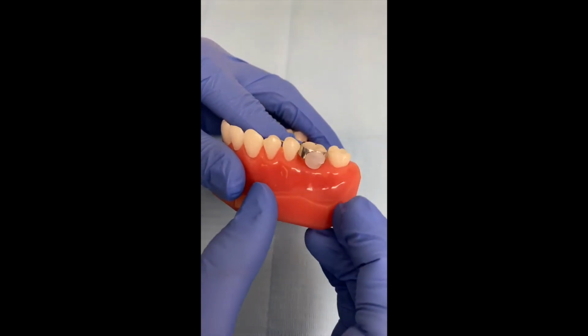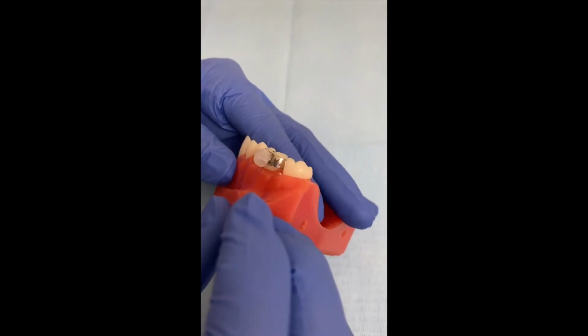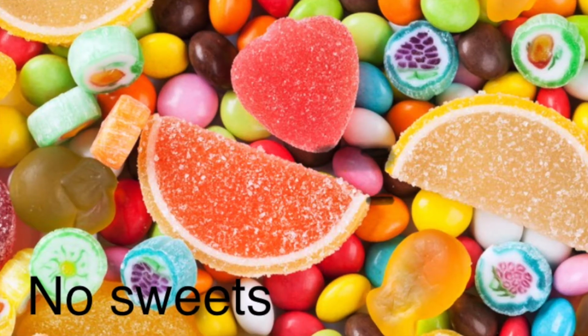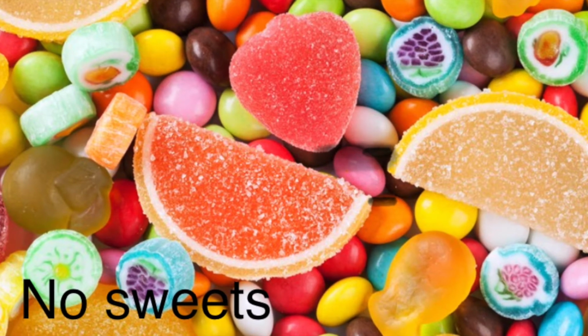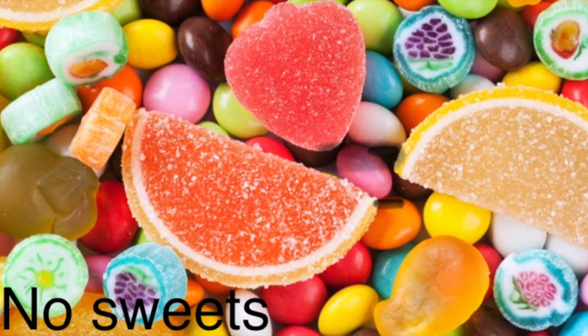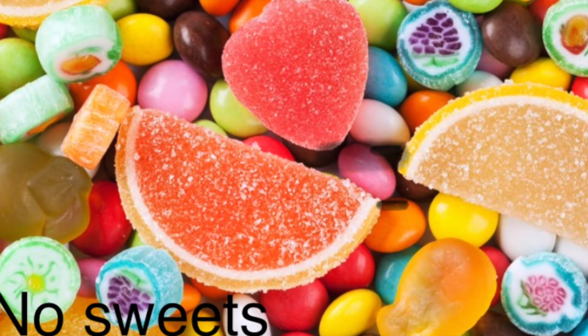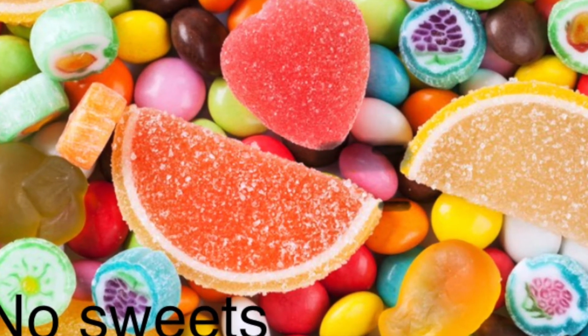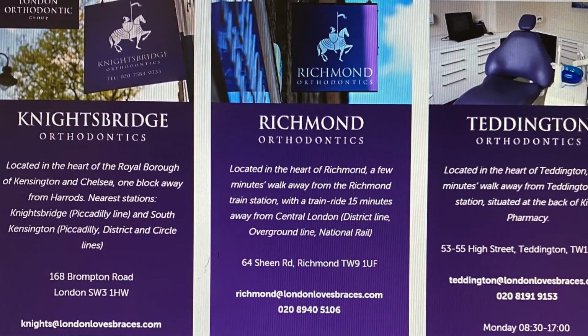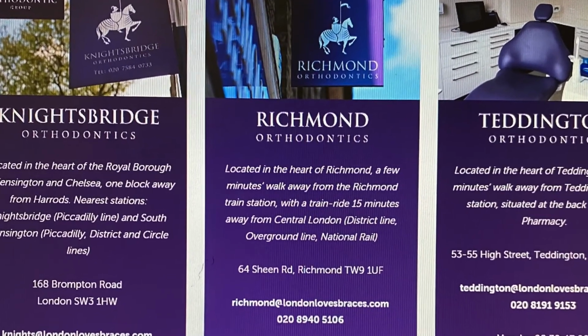The bands of the expander are fixed with special adhesive and should stay on for the entire duration of the treatment. Generally, it's very important to eliminate sticky food like sweets and gums or hard crunchy food, as these can damage the expander. If you feel that the bands are loose, please call us immediately so that we can check and, if needed, cement the expander again.